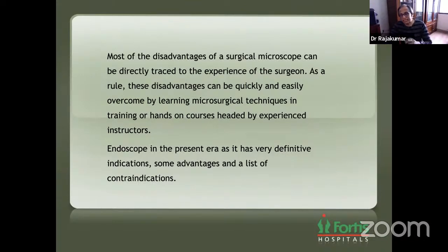Now, I think the disadvantage of microscope is actually directly related to the experience of a surgeon. As the experience becomes more and more, the disadvantages become less and less. Now, you can also add other instruments like endoscope. It has very definitive indications, a lot of advantages, a lot of contraindications too.